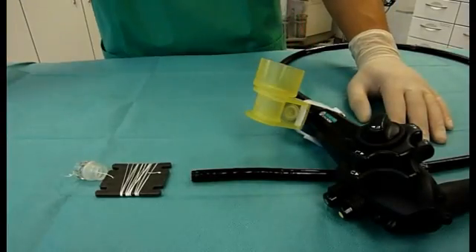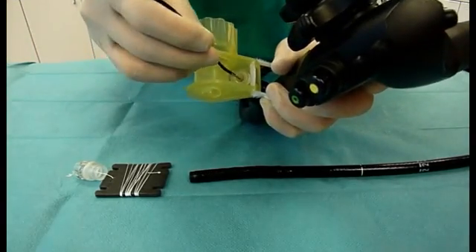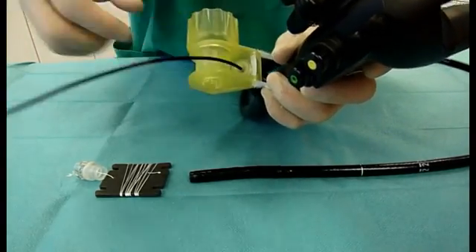To apply the OTSC applicator cap to the distal end of the endoscope, the thread is pulled through the working channel of the endoscope using, for example, a forceps.